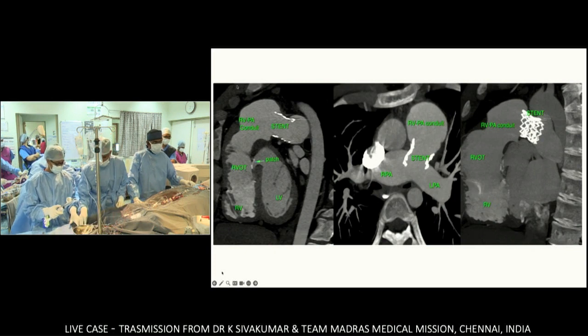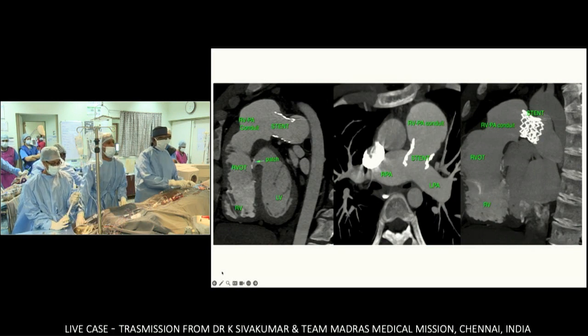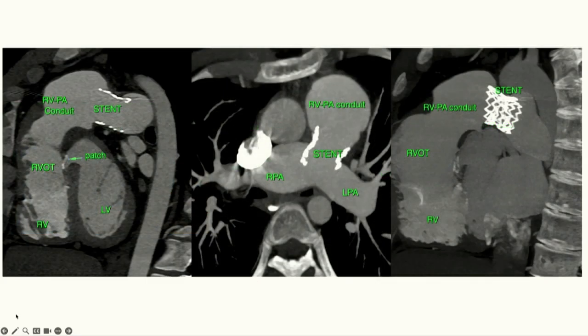No, I agree. Your placement is absolutely perfect. My concern is about stent shortening when you go with higher diameters. This is the Zephyr XL, which does not foreshorten at all. We have written the paper on this Zephyr balloon. It has got the C and S links, which prevent any sort of shortening. It doesn't foreshorten at all.